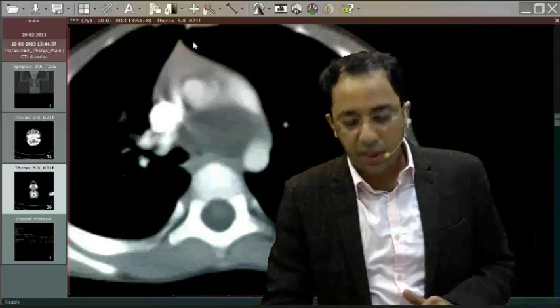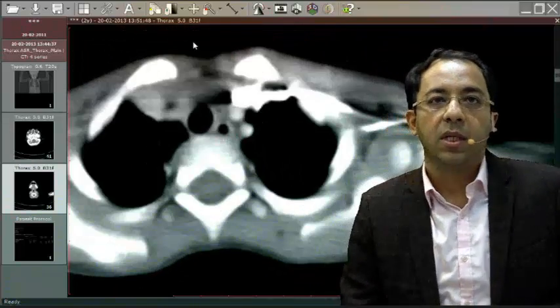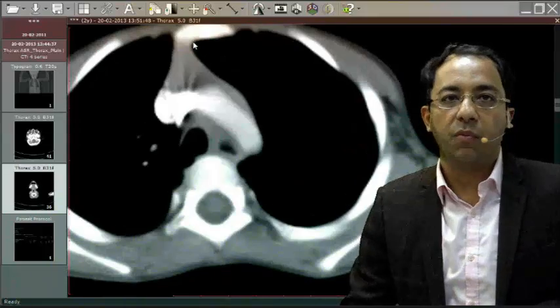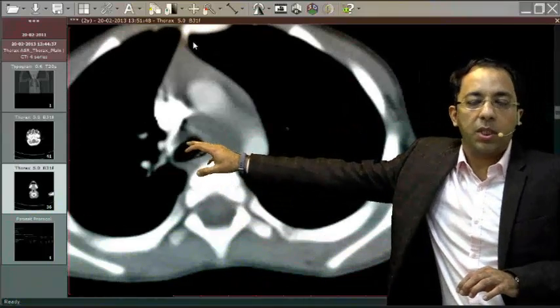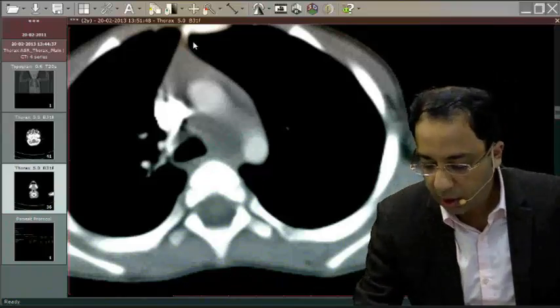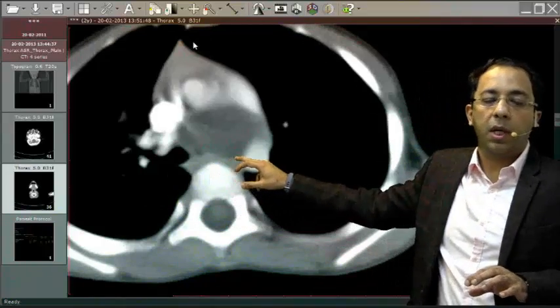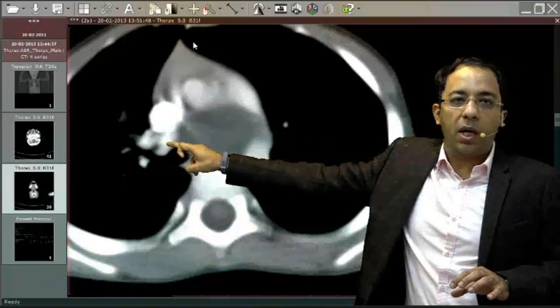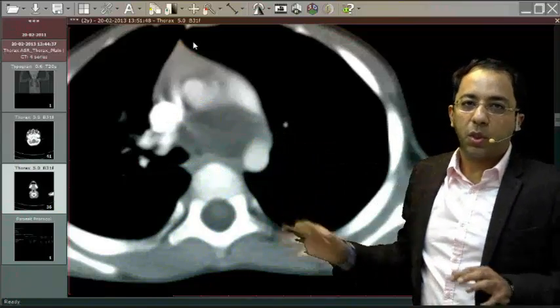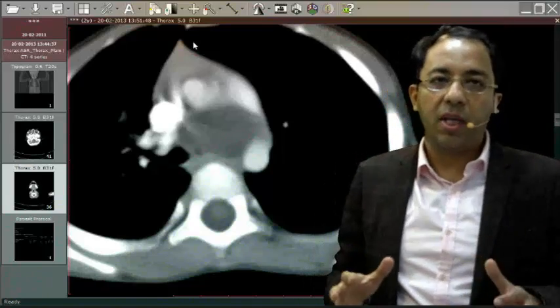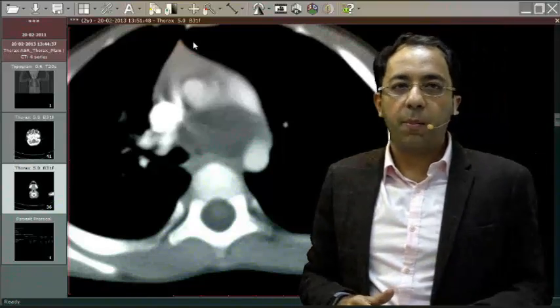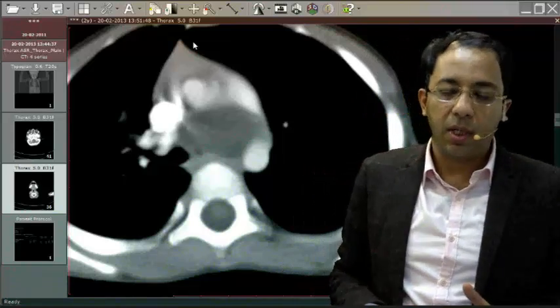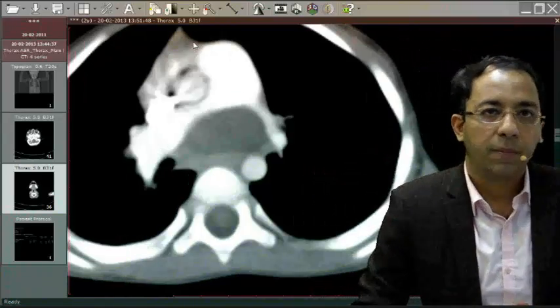Let's look at the mediastinal window as well. As you go down in the mediastinal window, this is the area of the trachea and now you can see the trachea is about to divide at the carina. You can see the right bronchus and what do you see here? A large fluid-filled area which is non-enhancing, it is not taking up any dye, no calcium, a fluid-filled area sitting at the carina. So we can say a subcarinal cystic lesion is seen here.